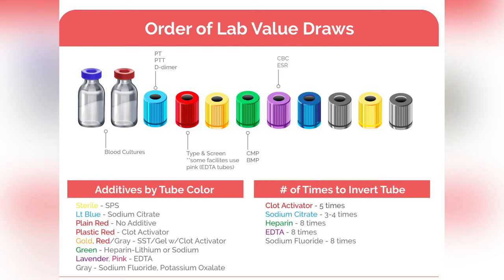EDTA tubes, plasma preparation tubes, PPTs: lavender, pink, or purple pearl top. Responsible for more carrying over problems than any other additive, elevates Na and K levels, chelates and decreases calcium and iron levels, elevates PT and PTT results.